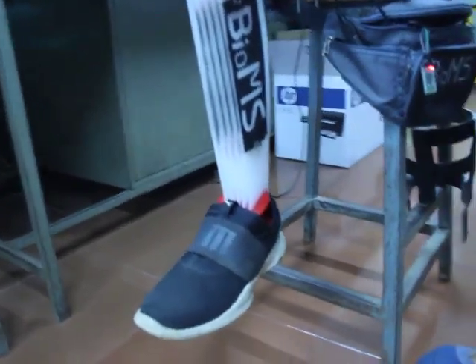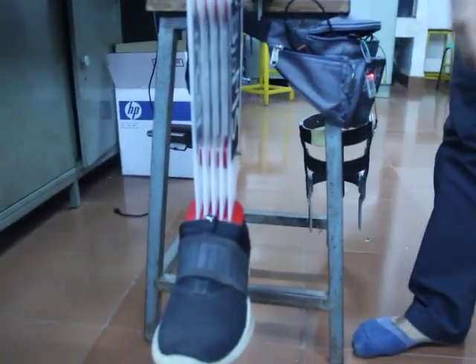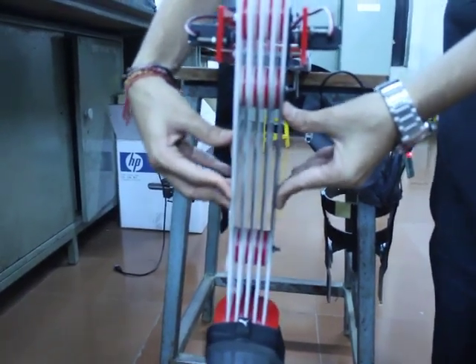Here you can see the prosthetic leg. As you can see, it is made of rigid material which does not collapse under any sort of applied pressure or stress.